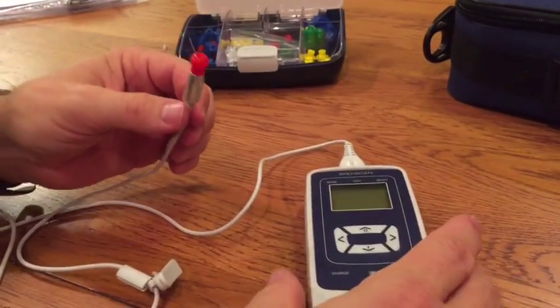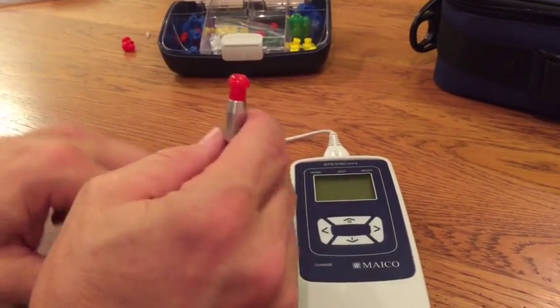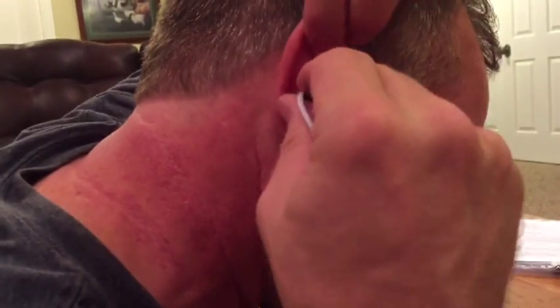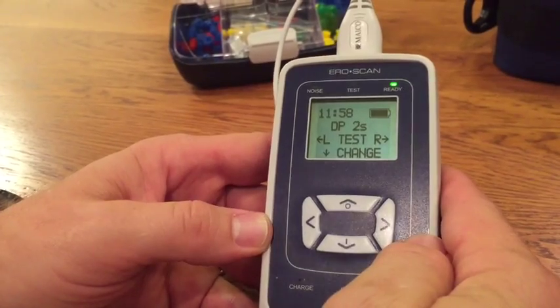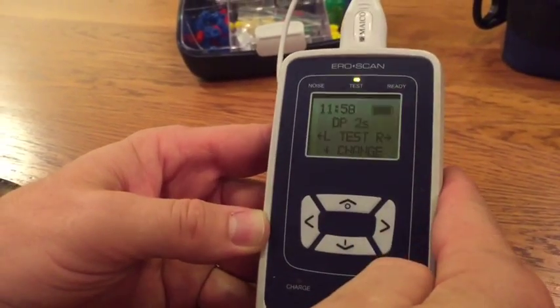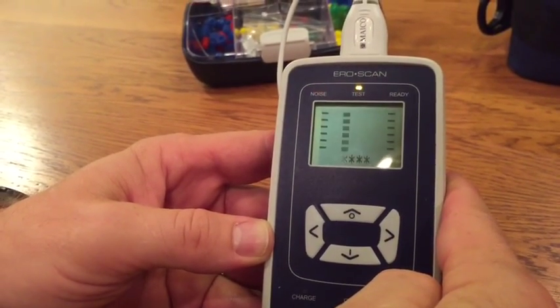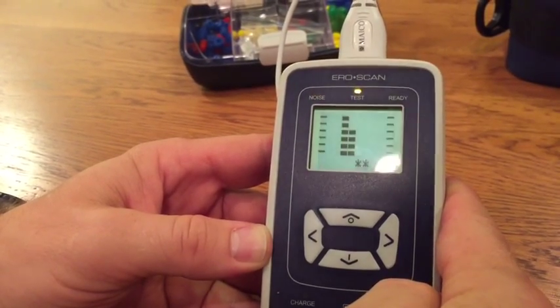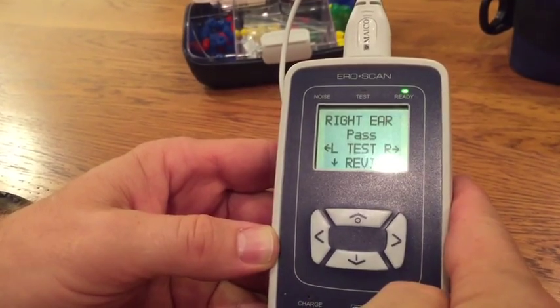The second exercise is to screen yourself in the presence of background noise, but where you as the person being screened remain quiet. Get a firm probe fit, turn your machine on, and have the person assigned to make background noise ready. Push the button and begin the screening, then have them go quiet — and the test should complete.